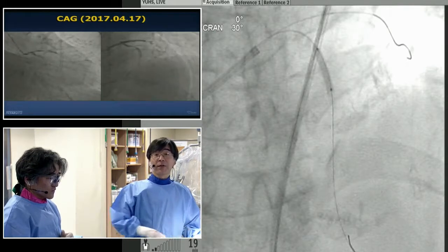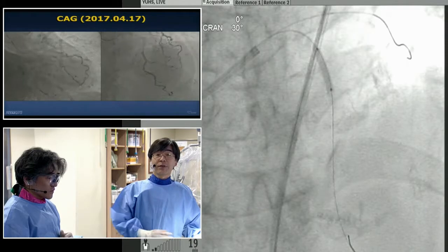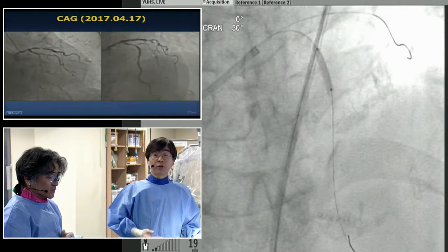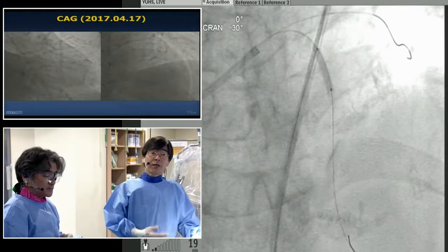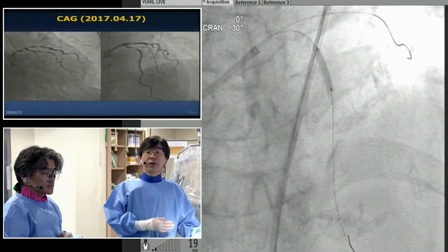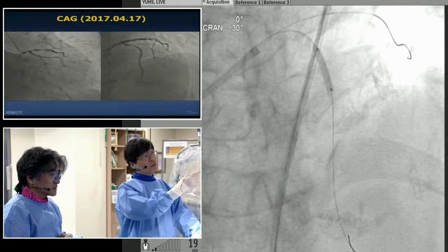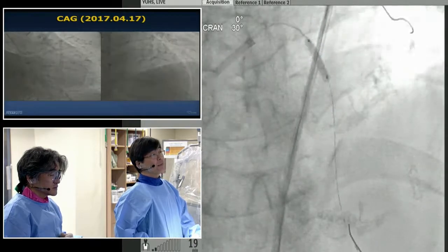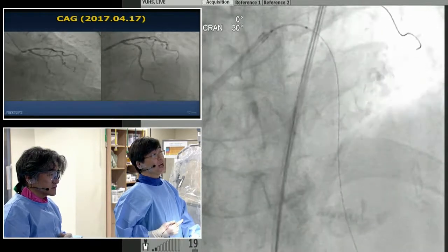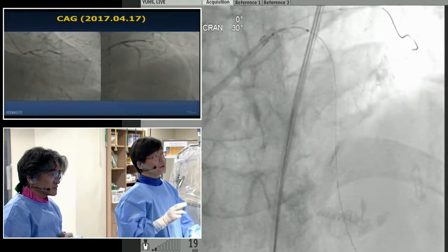particularly this patient, as this patient is an elderly patient. So there is the risk of bleeding. In this kind of situation, we prefer the Biofreedom. That is the real power of the polymer-free drug-coated stent. And then we will do balloon dilation of the mid LAD and proximal LAD, guided by the IVUS transducer, and the predilation.